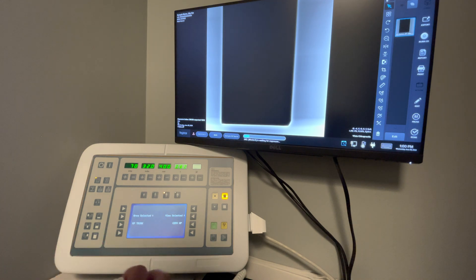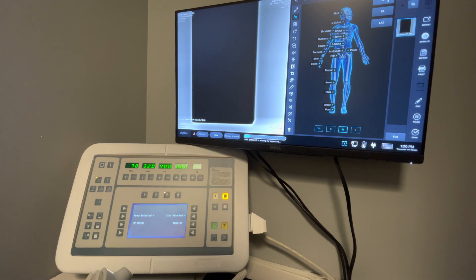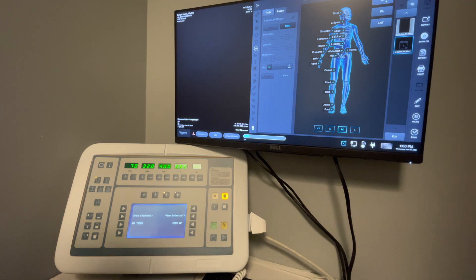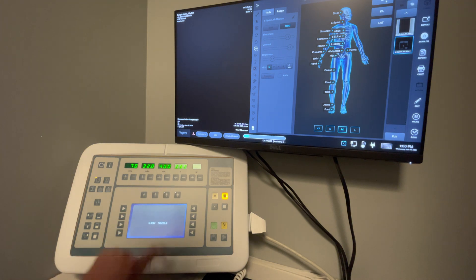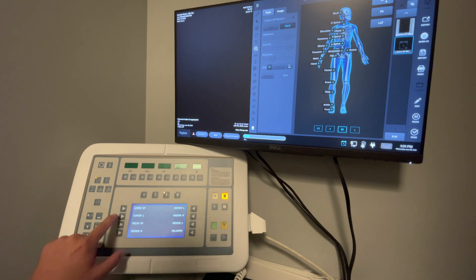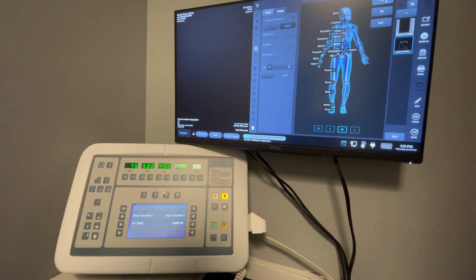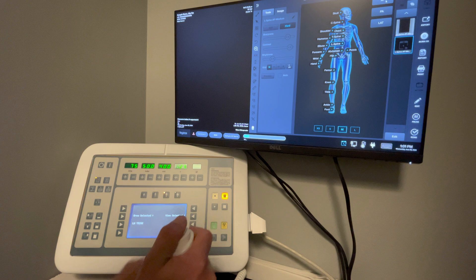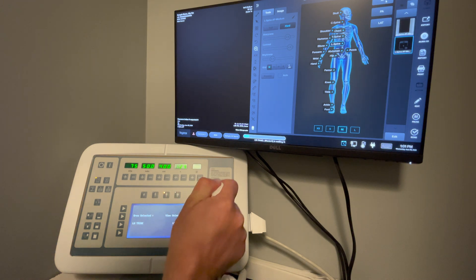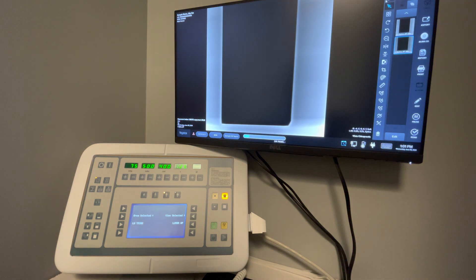To go back and do another view, click over here and choose another area. Say I want to do an L-spine AP — I go back, start over from the beginning, choose lower trunk, and then select lumbar AP. I can again adjust any of the settings, then hold down the prep and expose to take the image, which is then displayed on the screen.